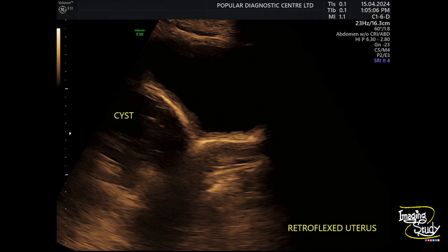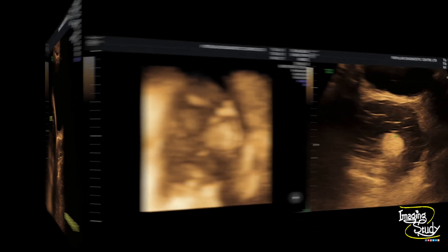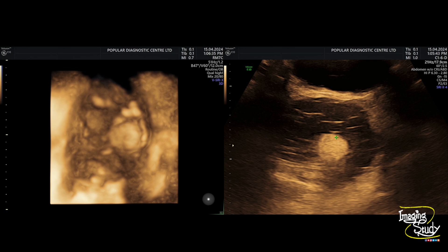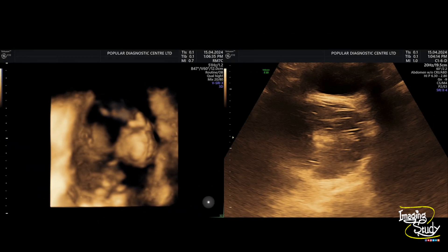Here is the longitudinal section where you can see a retroflexed atrophied uterus, and superior to it you can see part of the cystic lesion. We have tried to take some 3D pictures which may give you some idea about the inner components, especially if it has any calcified tooth or something like that. Here you can see the echogenic ball within this cystic lesion.